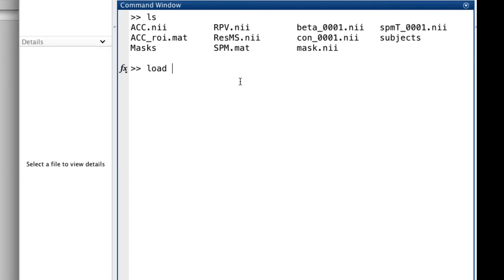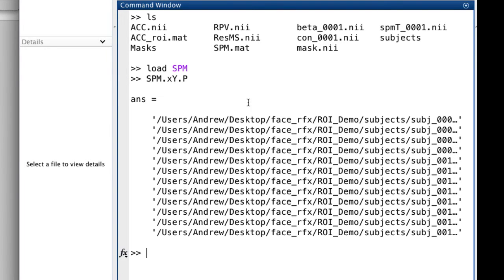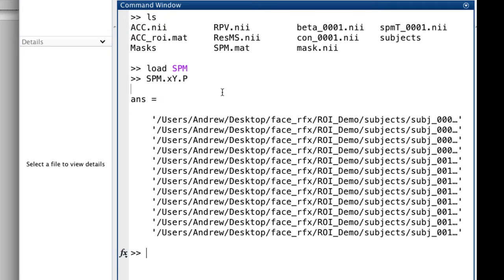And then within that, you have spm.xY.P, which is a list of all the paths to all the contrast images we were talking about earlier. We also have in this directory our ACC ROI.